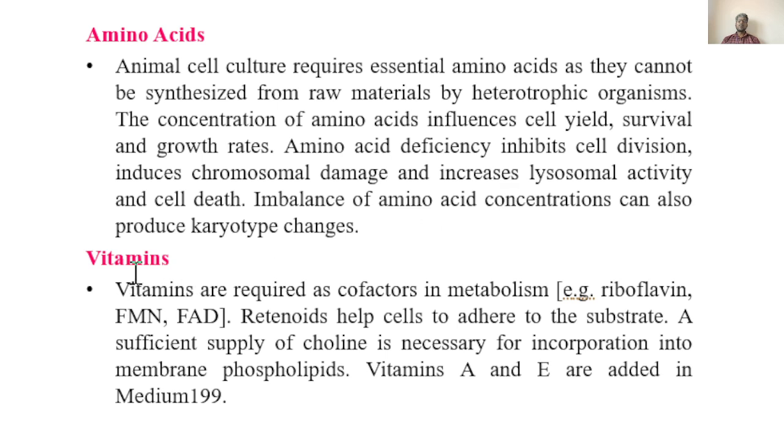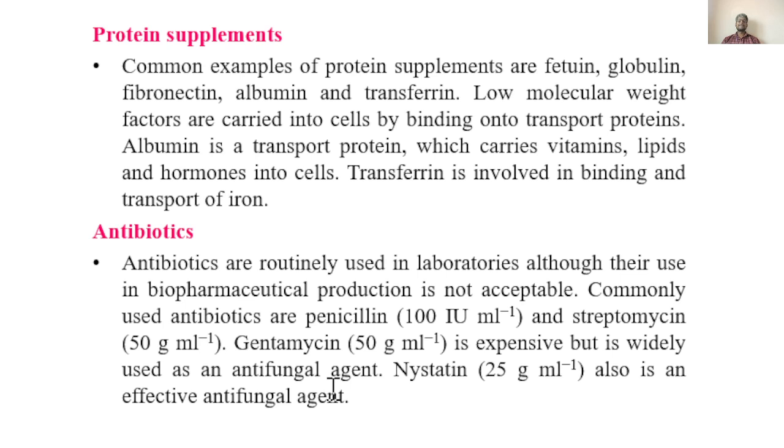disorder occurs. Vitamins are other small molecules used as cofactors in the metabolism of cells, and especially choline is necessary for incorporation of membrane phospholipids. Protein supplements: there are a lot of growth factors, transcription factors and proteins being used as small molecules in different events, like transport protein that binds with iron, which helps in uptake of iron. So there are different small molecules involved.